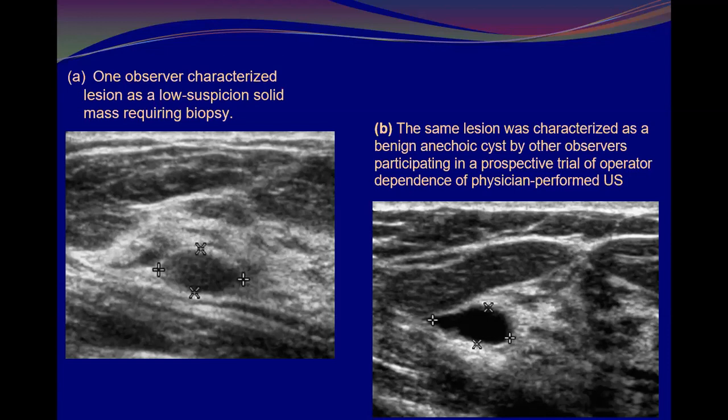We said it has to be optimized to have optimum contrast, not an over hyper-contrasty black and white image, and not lacking contrast. If you look here, there is lack of contrast. Everything looks the same, and even the resolution is affected. But this is good, medium gray.